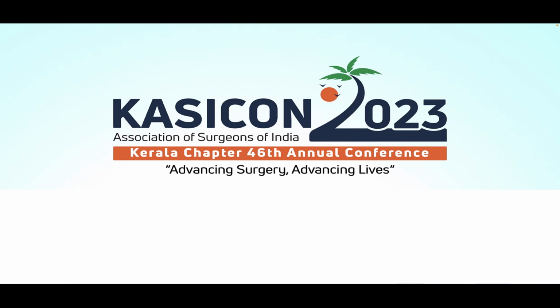One more disadvantage is that the retroperitoneum and the preperitoneum are also not better assessed by the E-FAST. Definitely, yes. Thank you for pointing that out.